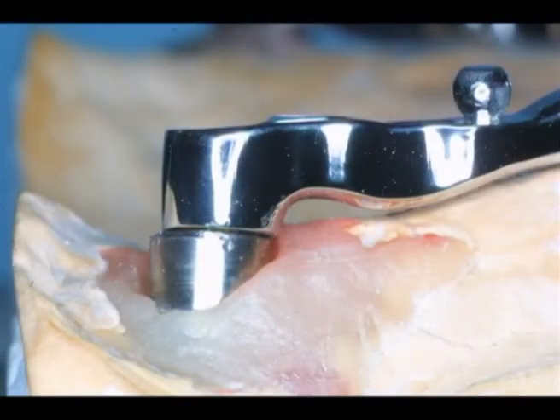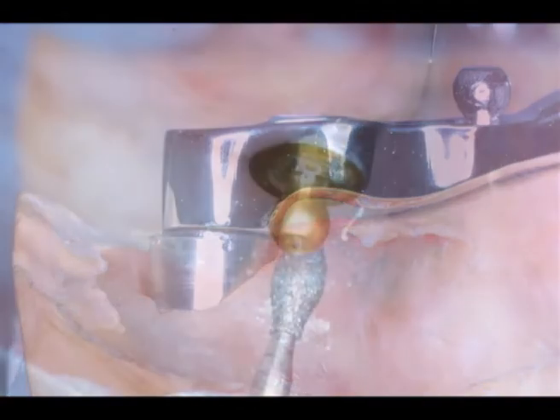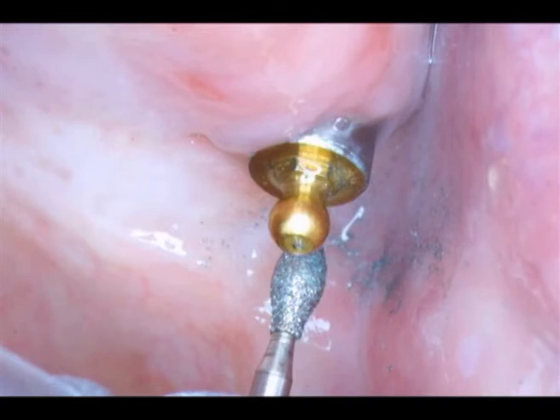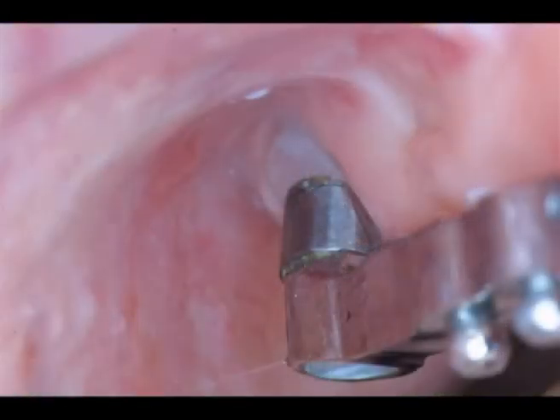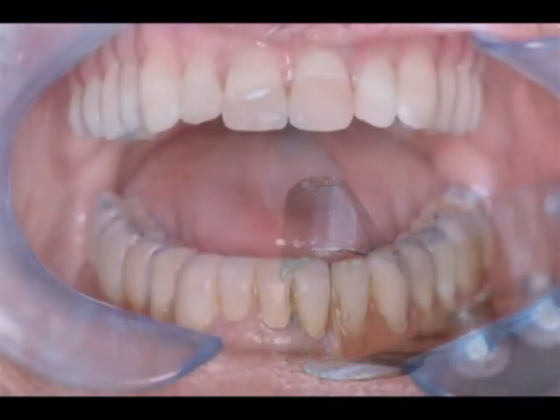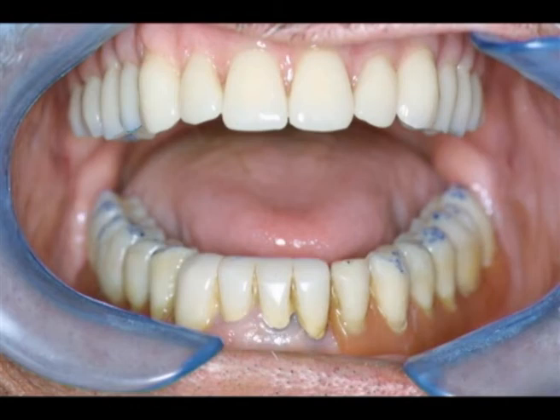Full X-ray. Detail with evident altered bar implant connection, caused probably by an imprecise location of the fixture in the mouth and the analog on the model when work was done. The problem is solved by refining the attachment sphere located in the annular ring. When work is done, cement will lay into the annular blocks slightly above the gingival margin. A small gap between attachment and ring is evident, but it won't compromise the final result. Finished denture, selective grinding.